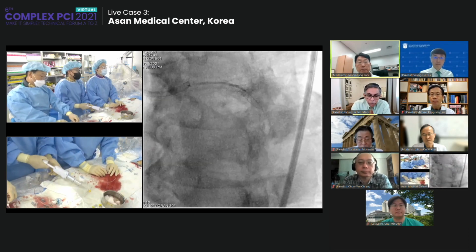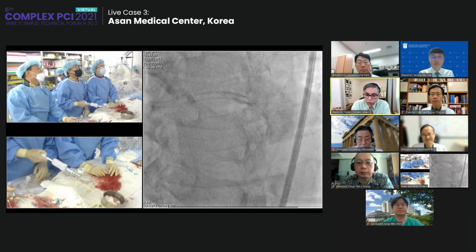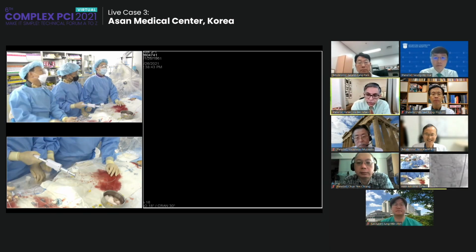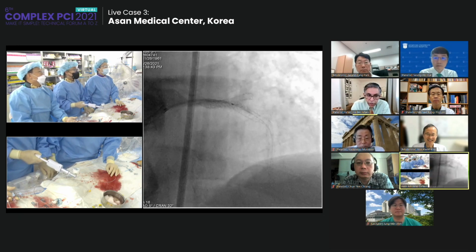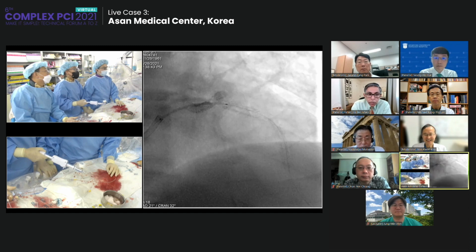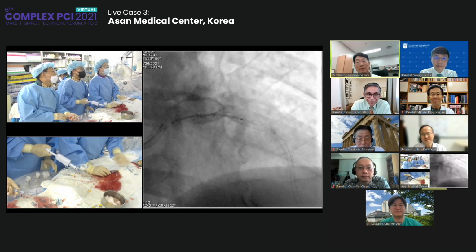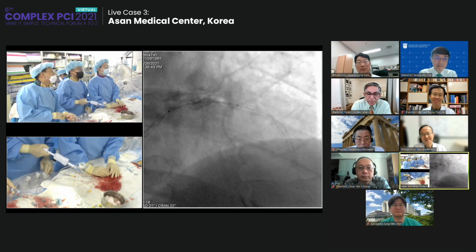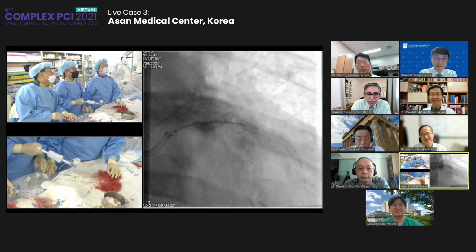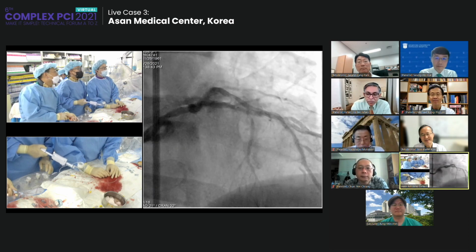Maybe I can ask Dr. Park a question. Why not DK crush? What are your thoughts on DK crush versus the mini crush that you're using right now? DK crush in our center is a little bit too complex, and we believe that we could get a comparable outcome with this step. I think you're probably right.